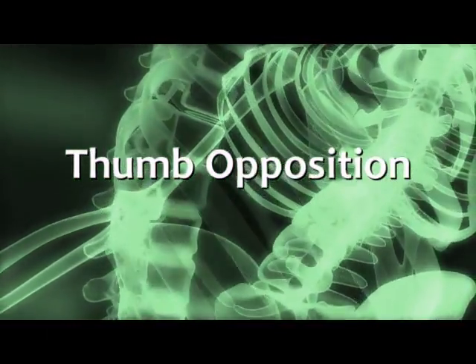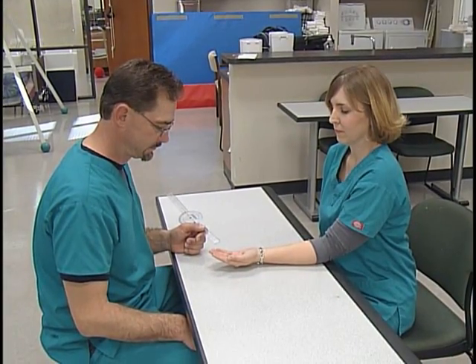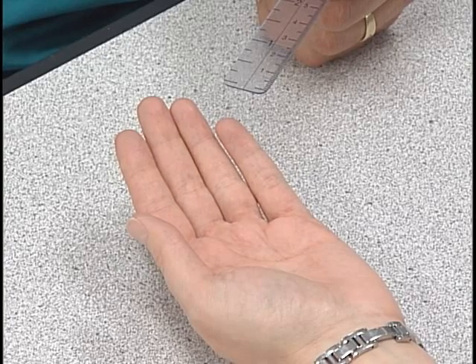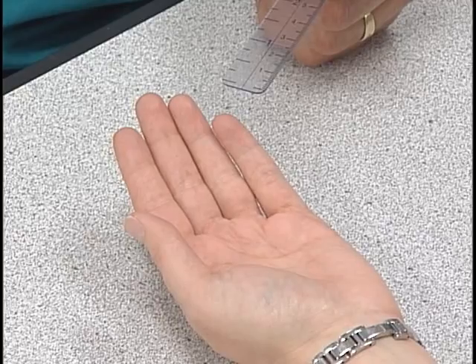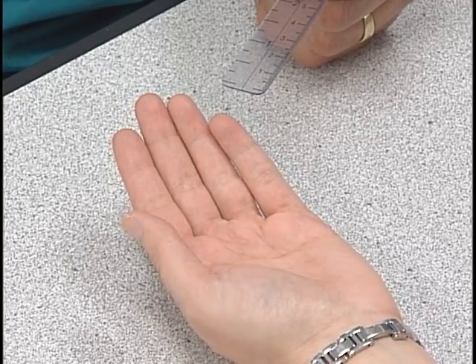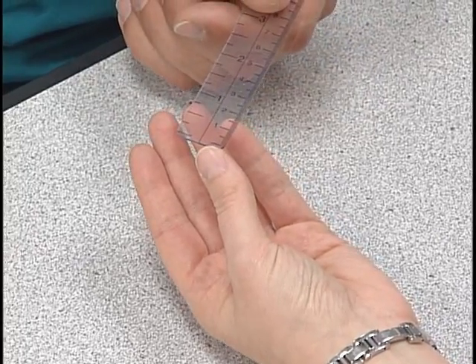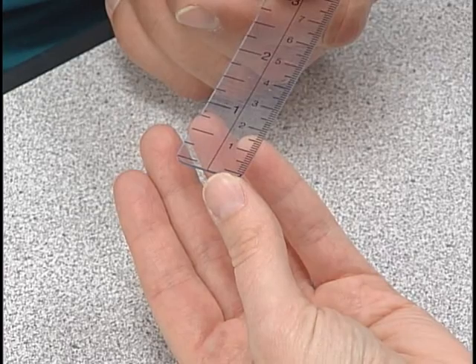For thumb opposition, the subject is seated with the palmar aspect of the hand exposed. The goniometer measures the distance between the thumb and fifth finger pads using the centimeter part of the goniometer. The client's thumb and fifth digit are opposed to one another. The measurement ranges from zero centimeters up to seven centimeters.